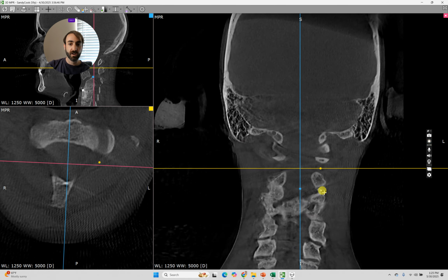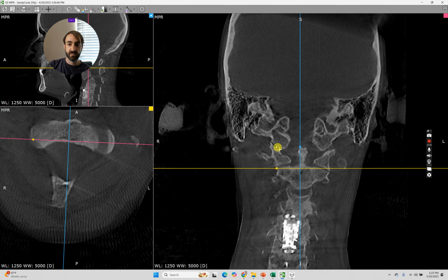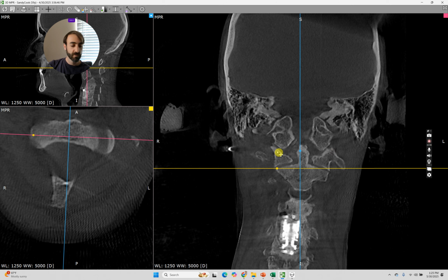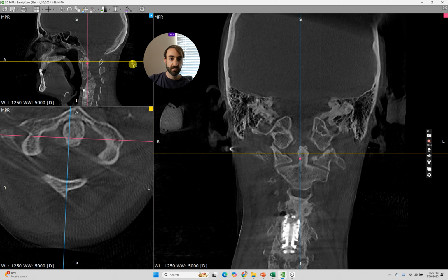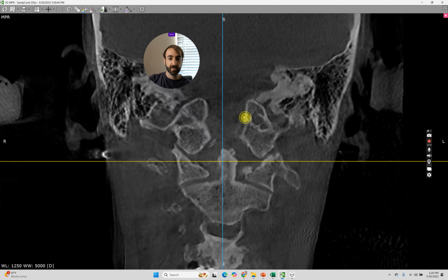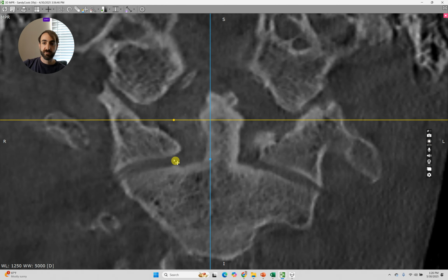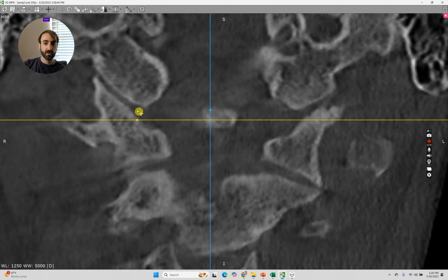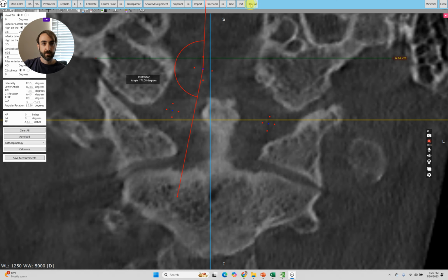We need to look at our condylar circle, and we can scroll pretty clean up until we see our atlas, and here's the base of that condylar circle. And so we're going to go ahead and just kind of get this ready for measurement. I usually leave this kind of right through the atlas there, and then I'm going to open this up and get a nice zoom in. And we kind of scroll till we find a slice that looks like we'll be able to get some really good symmetrical measurements off of, and we'll drop a line for calibration. We'll use the calibrate tool here to teach the Toolkit the length of this line.